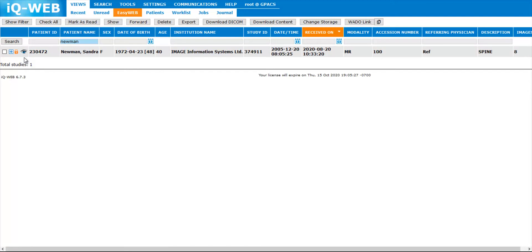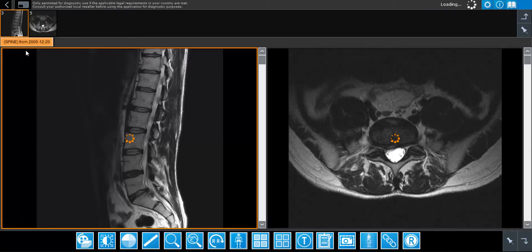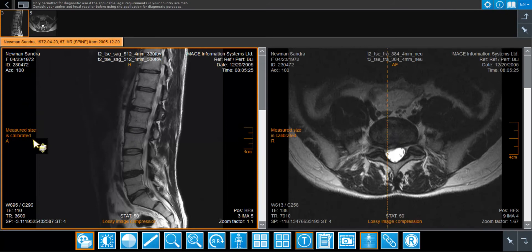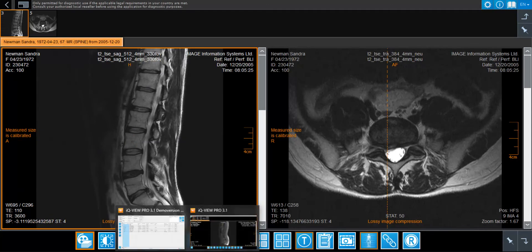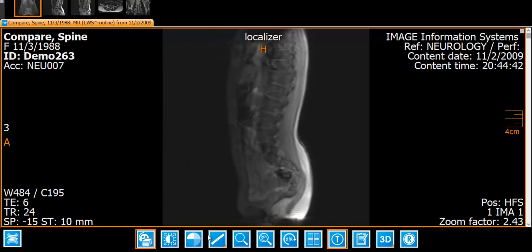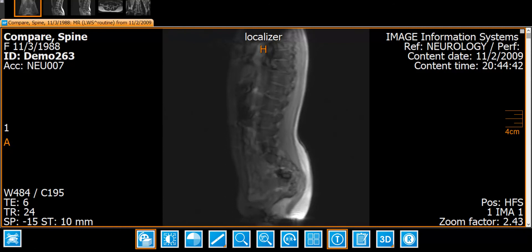This way, the radiologist can simply minimize and park the current study in the viewer software, move to the PACS study browser, and open the study in the PACS Viewer IQ4 view to see the images. After they have dealt with the emergency study, they can simply maximize the iCUE View Pro viewer again to continue reading their original study.